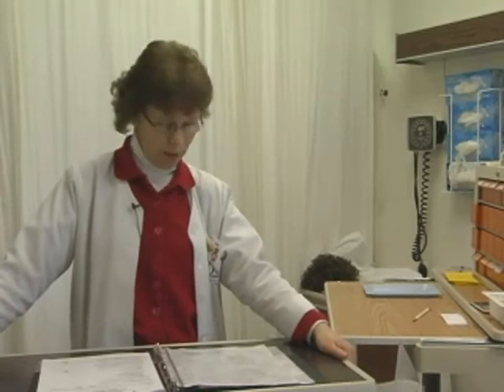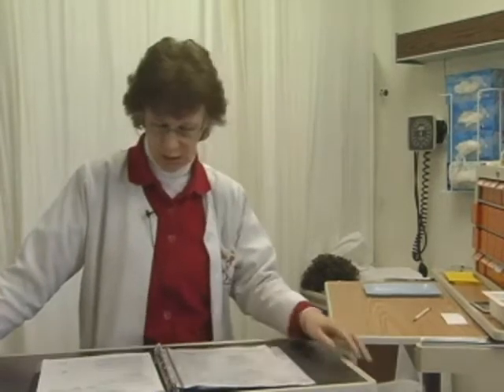And then I would do my research on my medication. So I need to check the classification, the desired or therapeutic effect, the dosage range and route, nursing implications, pre-administration assessment, compatibility with the primary IV, and any dilution requirements that there may be, and the length of administration time. So when I'm looking at this, it's to be given over 2 minutes. I also need to check my patient for allergies, and he is allergic to tetracycline.